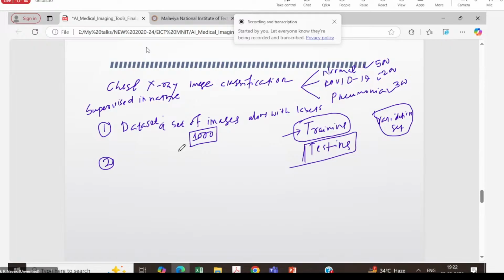There are various ways to split a data set into train set and test set. Sometimes, fortunately, the dataset developers provide the train set and test set separately. Then you need not do anything. You simply take the train set, process it, and after designing the model, pass the test set images and evaluate the model. But if the official split has not been provided to you, then what will you do? You have to split by yourself.